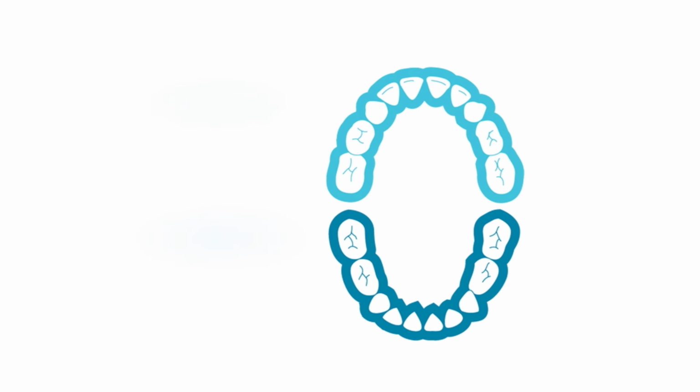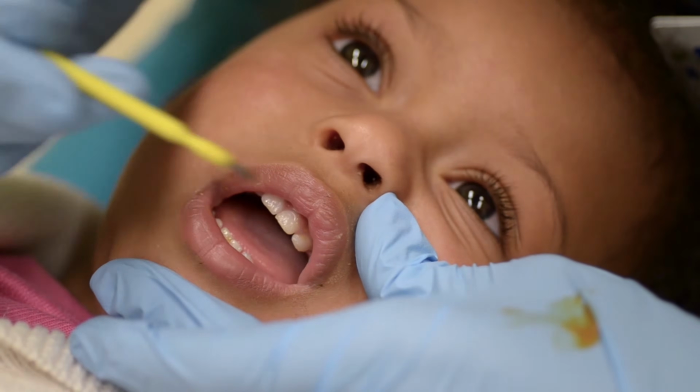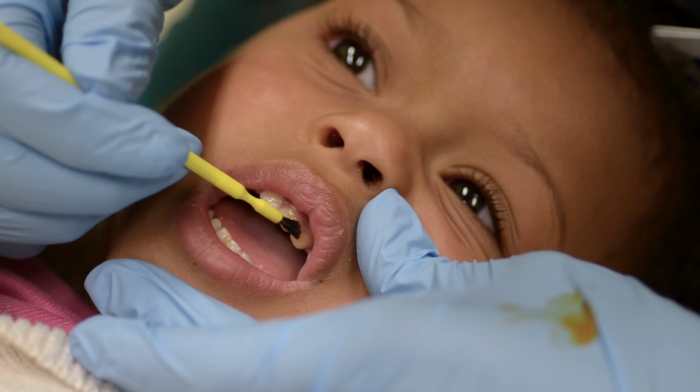Most providers apply the varnish in quadrants to be sure to paint all teeth that are present. In children 2 years and older, who typically have 20 teeth, start with the left upper back, then move down to the lower left, then lower right, then upper back, and finally the front, upper, and lower teeth. Most varnish comes with a yellow tint, so you can keep track of where you've already applied it.